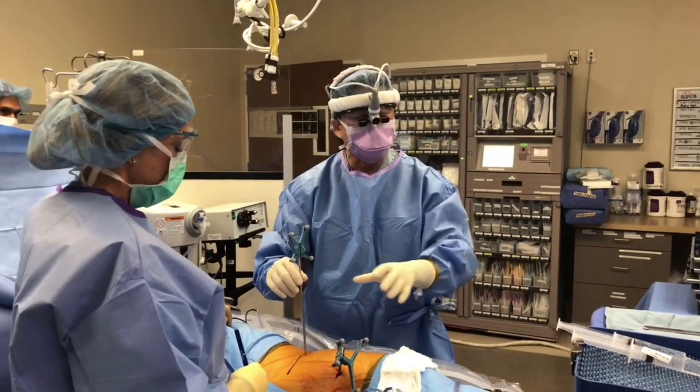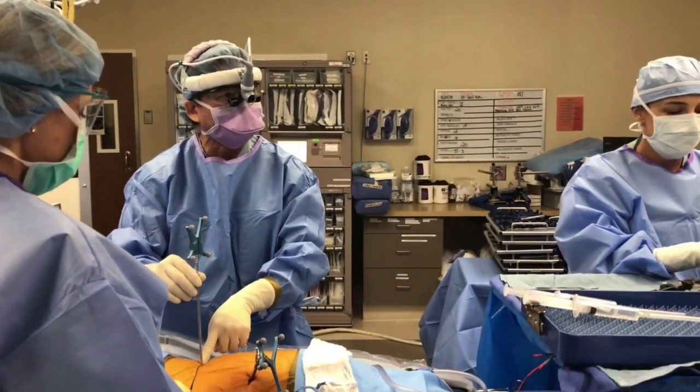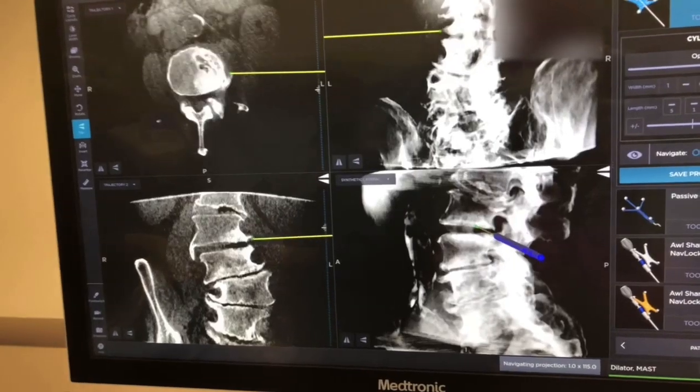We're about to get started. We have the navigation tracking pin in and we have the 3D images. I'm using this navigation probe to identify the perfect entry point for your surgery. That's how I'm going to make the incisions as small as possible but make it in the proper location.